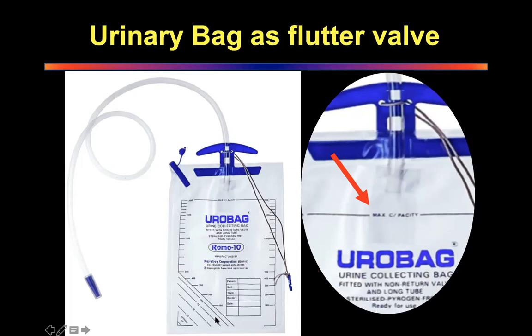So that any fluid that collects, he just has to keep it straight so that it doesn't fall off. And every morning he just measures it, writes it into his diary, and then throws the fluid away. So the whole idea is to throw the fluid away, not to keep it in the bag. I've seen people very proudly carrying 800 ml in it. That's not the point. The point is you have to throw the fluid in the sink every day.